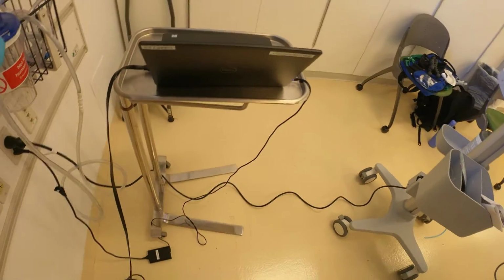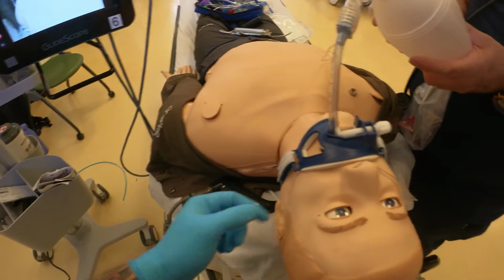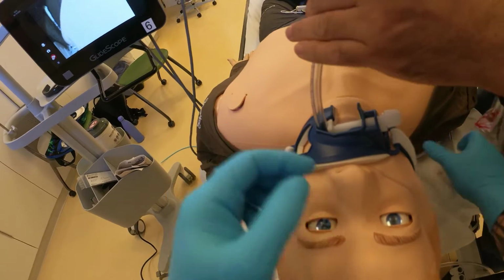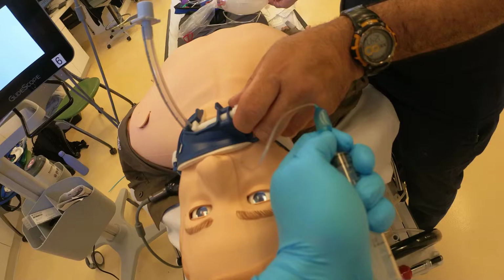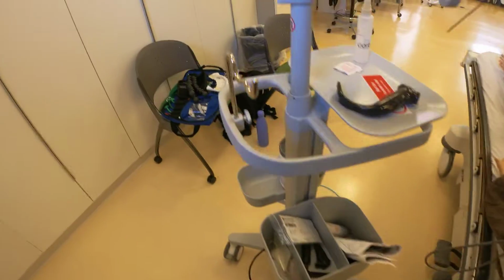And then the final thing I'm going to show you with this device, we're going to disconnect it. I'm going to show you how to use a gum bougie, what's known as an endotracheal tube introducer, right? So we're going to disconnect it. So the procedure is going to be the same, right? So pick up my bougie.